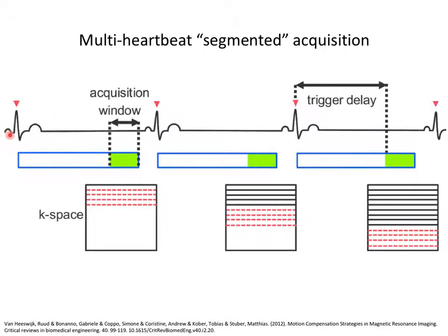You put leads on the patient's chest, and you measure their, here's the P wave, and the QRS, and the T wave. Normally you don't see this in MR. You don't really see a very good P wave with these leads. You see a QRS, which is distorted, and you see a T wave, which is usually distorted.